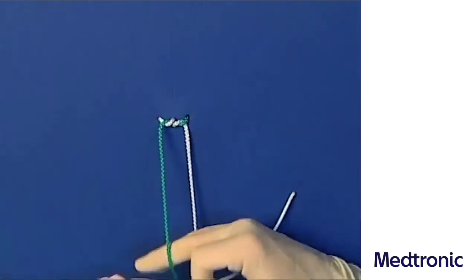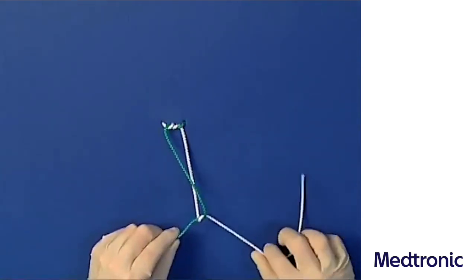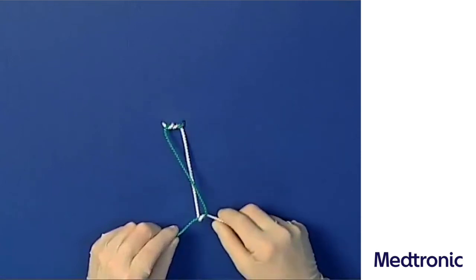The second loop can now be made with the right hand using the middle finger technique. Again, the hands have to be crossed anti-clockwise.